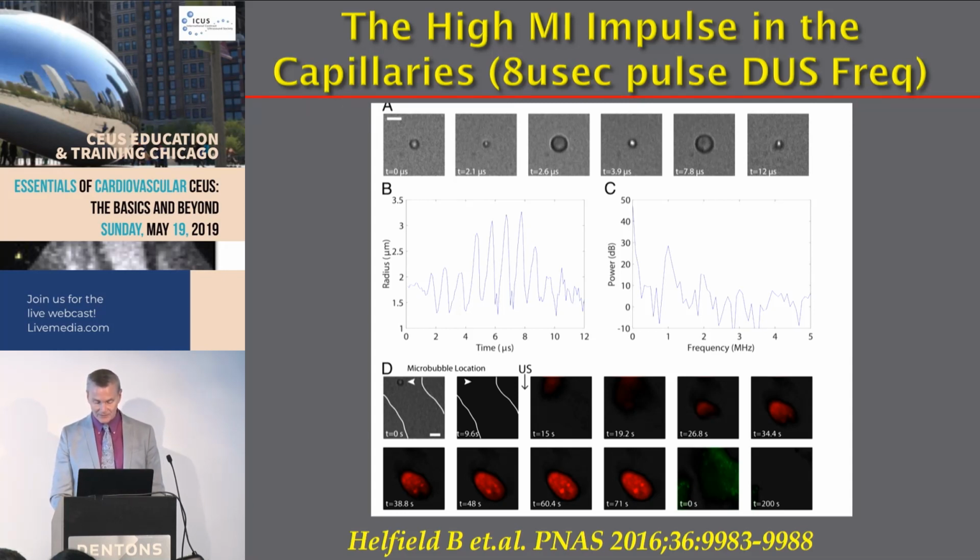Well, shortly after this event, which occurred next to an endothelial cell, and these are the cells that line our vasculature, you can see the propidium iodide doesn't start to take up color until it gets inside the cell. Once it gets inside the cell, it starts to change color. So we start seeing propidium iodide filling inside the cell. As Steve pointed out today, a pore has formed, that over a period of about 70 seconds becomes fairly intense and starts to concentrate in the nucleus of the cell. And if you look at calcium release with another stain, a calcium type stain, you can see all the calcium comes out of the cell and becomes extracellular. By 200 seconds, the whole process is over.